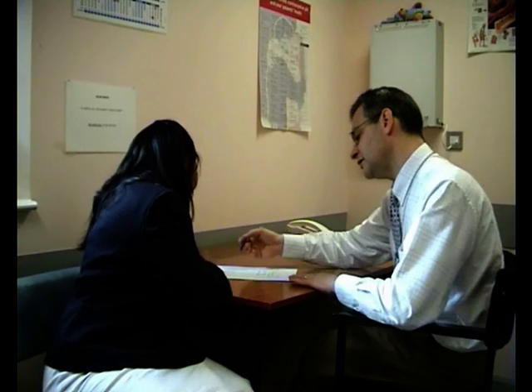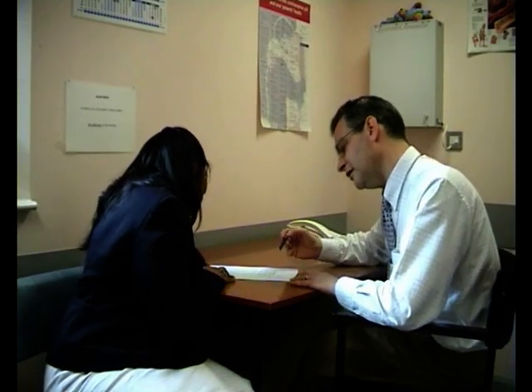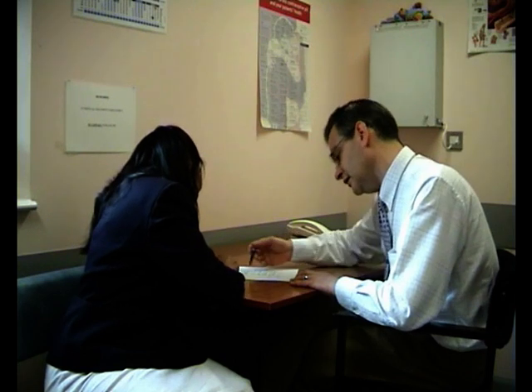Could I just ask you which line relates to the urine flow rate? The browny red one. There's another line there as well, isn't there? What do you think that represents? That is the voiding volume. Yes, the volume voided. Correct. Okay, carry on. And this line is the detrusor pressure, which is measured in centimeters of water, and it ranges from 0 to 100. And this is the abdominal pressure, again measured in centimeters of water, ranging from 0 to 100.